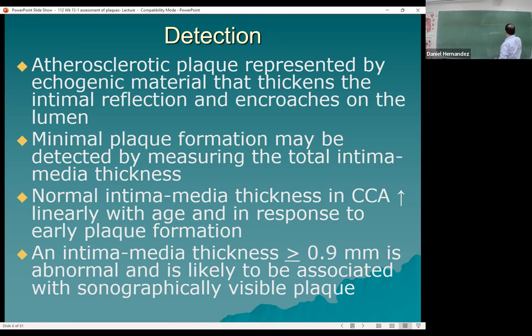But there's a layer of soft plaque over it, so when I put my color flow on, the color flow would go around that plaque, and this part will fill with color. It would unmask maybe a more severe stenotic lesion or more severe plaque that just seemed more hypoechoic or even anechoic. That's why we also use our color. So we always do grayscale, and we always do color, for all the segments that we're imaging for carotid. Makes sense. Thanks.